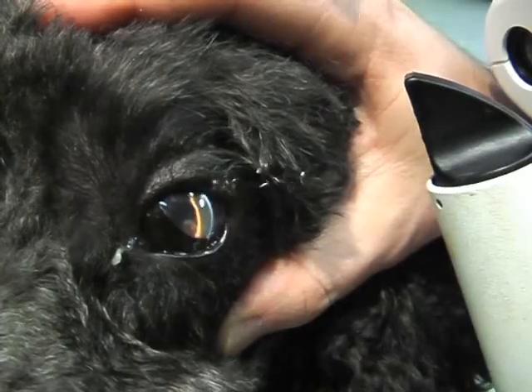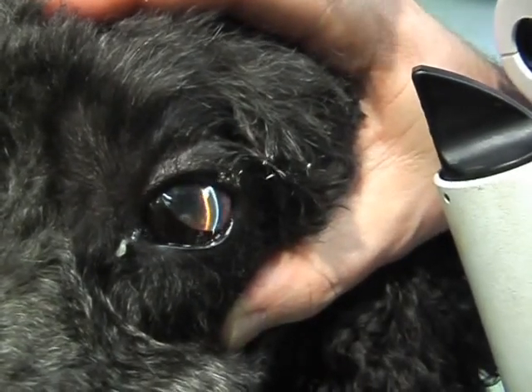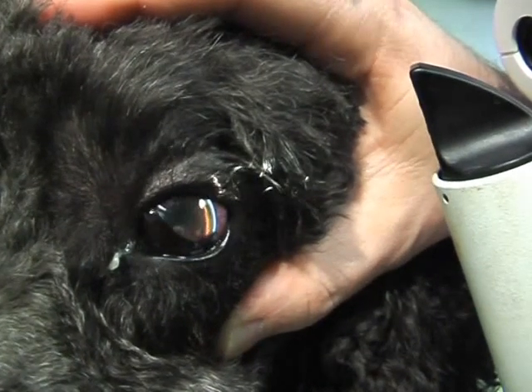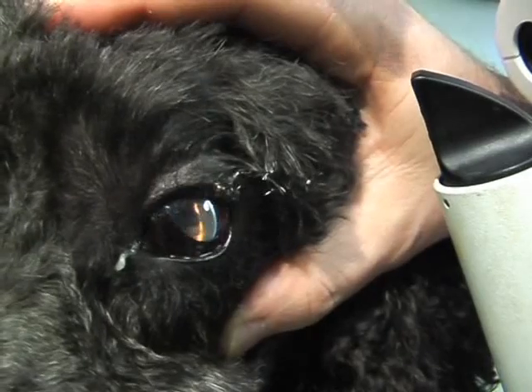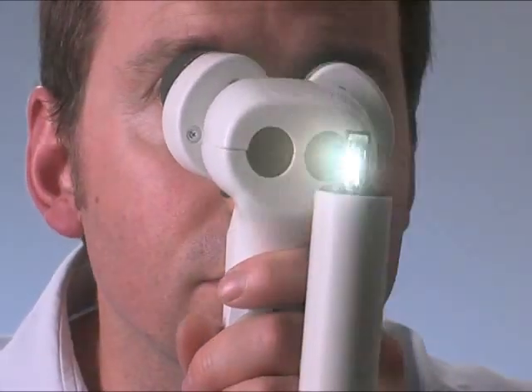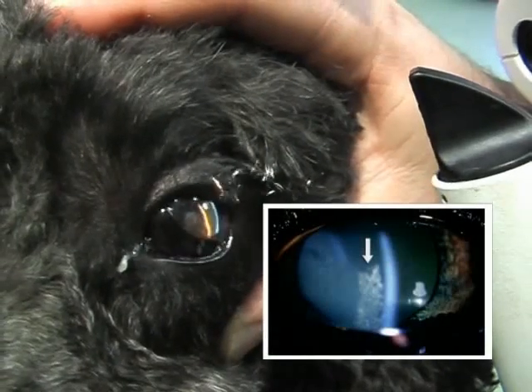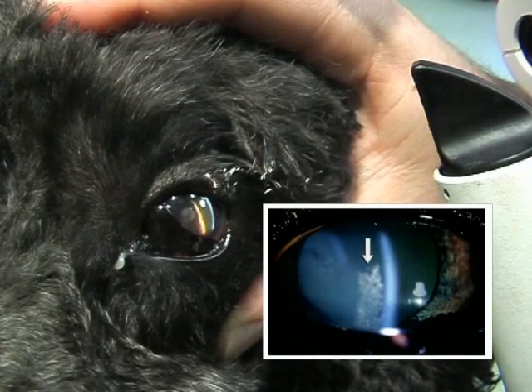Plasma protein in the anterior chamber can produce an optical effect known as aqueous flare. While this is frequently a feature of uveitis, a highly focused light source, such as the slit lamp biomicroscope, is often needed to detect it. Note that here again, uveitis resulted from corneal ulceration.